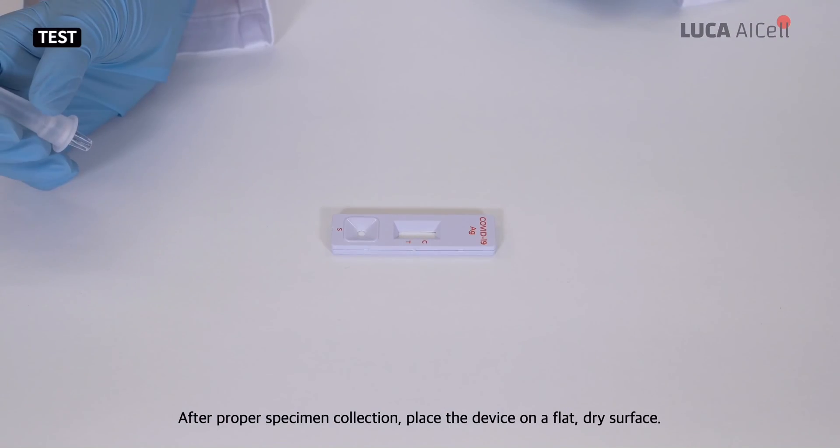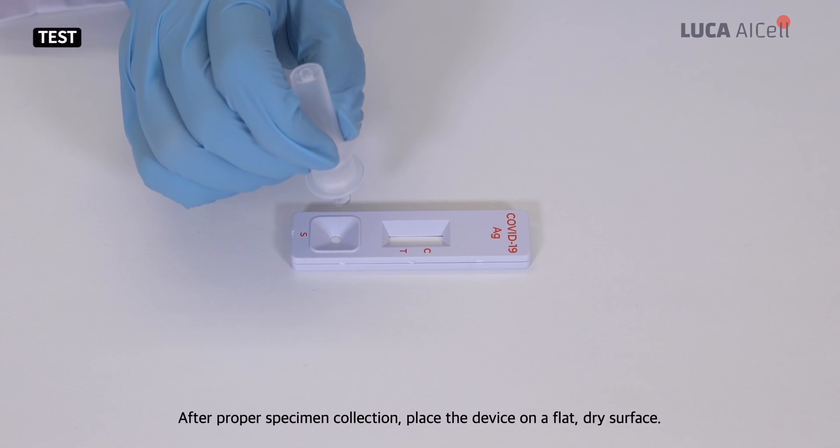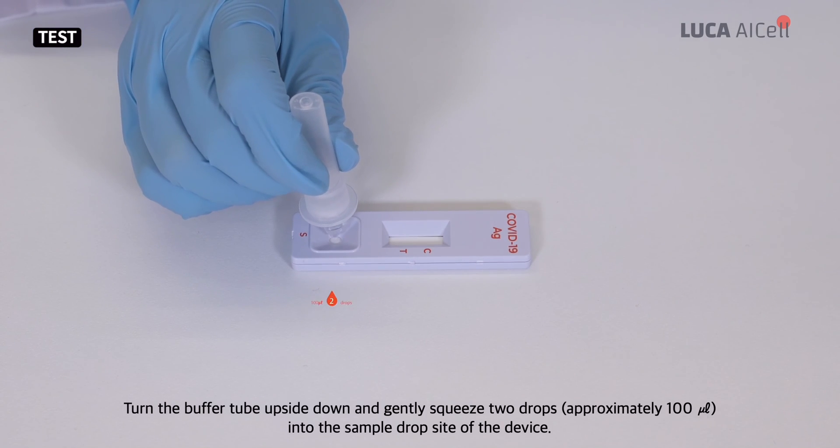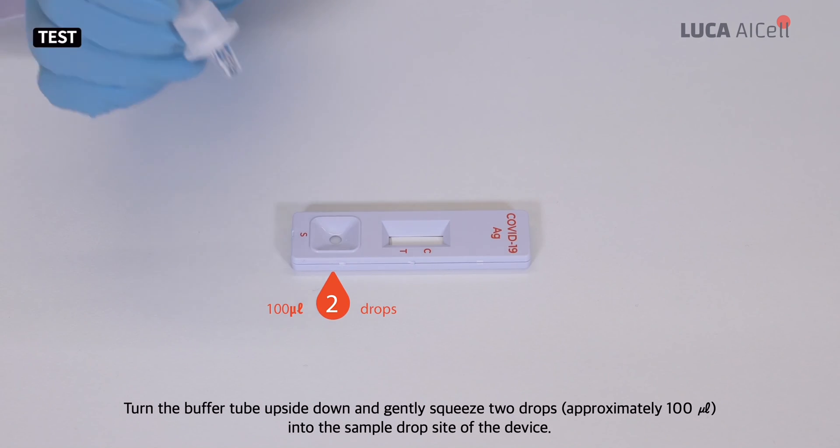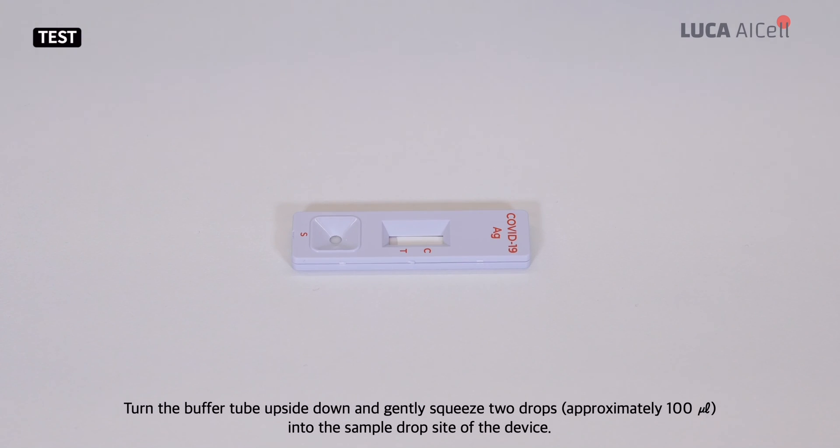After proper specimen collection, place the device on a flat dry surface. Turn the buffer tube upside down and gently squeeze two drops, approximately 100 microliters, into the sample drop site of the device.